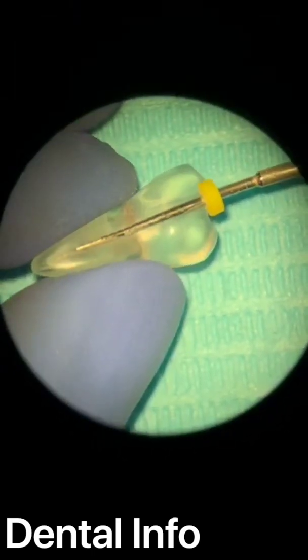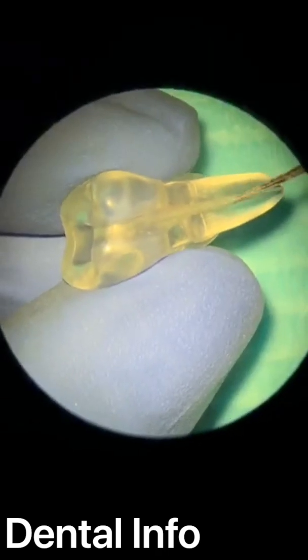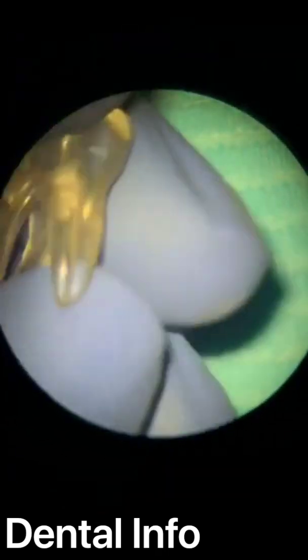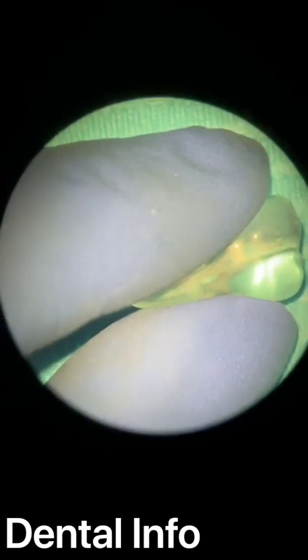I will use it. I will set the stopper, because in the real patient, what I see this, I don't see this. I am not working like that. It's just a transparent tooth. You can just demonstrate the situation.